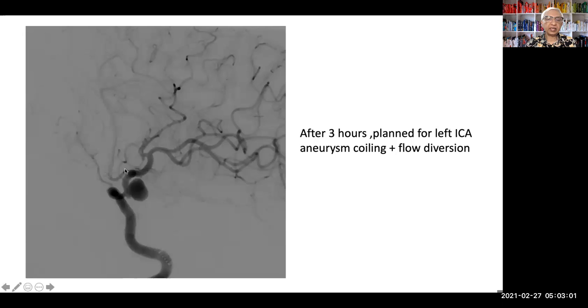You can see a very tight loop at this point, just as the aneurysm originates. The daughter aneurysm just below that, or a dysplastic segment, a narrow segment, and a very, very tight loop as it comes down. Obviously, it is going to be difficult to get the flow diverter to open across all these segments. And whenever we have such long dysplastic segments, it's important that we use a longish flow diverter so that you can push-pull much more effectively. If you have a shorter one, which is very precise, you'll find it gets very challenging because we come to the point of no return very, very early.